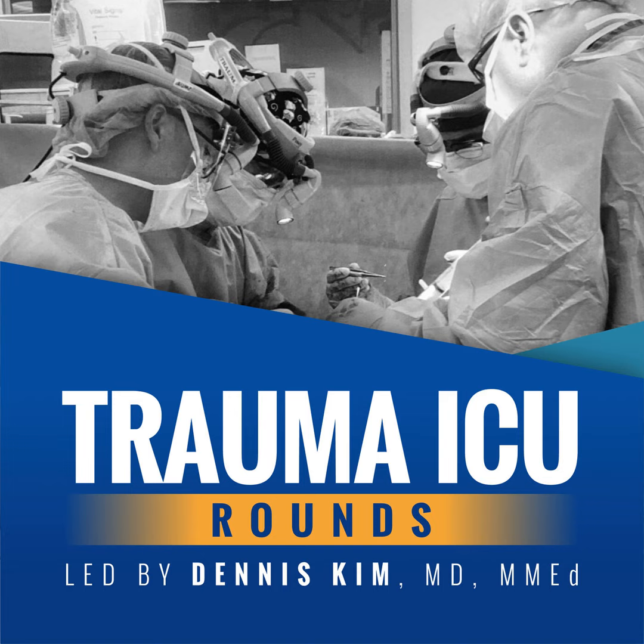And I think this is the main advantage of volume ventilation, namely that we can be assured that patients will receive a specific or guaranteed minute ventilation at a constant flow rate, usually, by dialing in a few preset variables. For example, by setting a respiratory rate of 10 and a tidal volume of 500 cc's, we know that our patients will receive a guaranteed minute ventilation of 5 liters, regardless of changes in the underlying airway resistance or lung compliance.